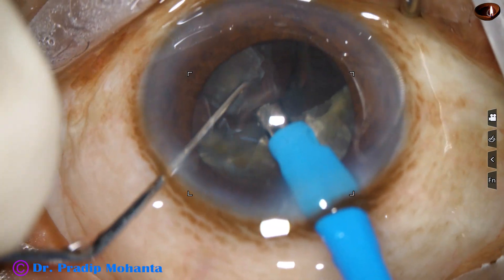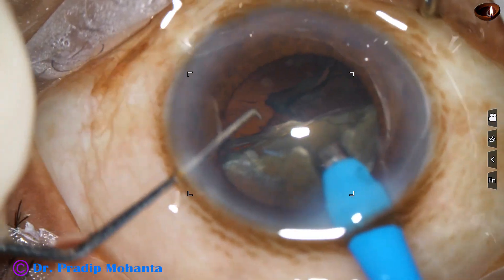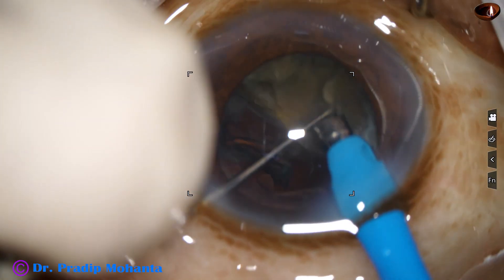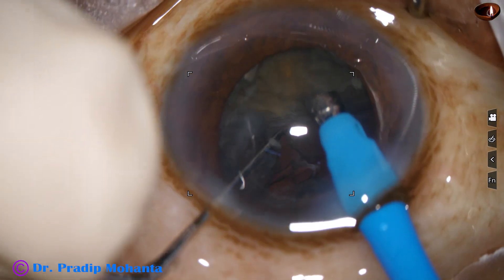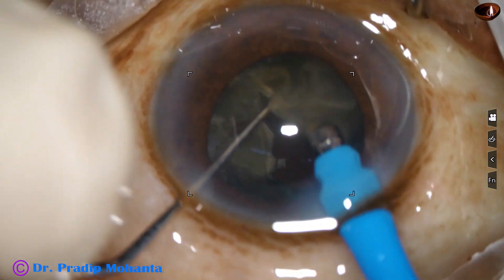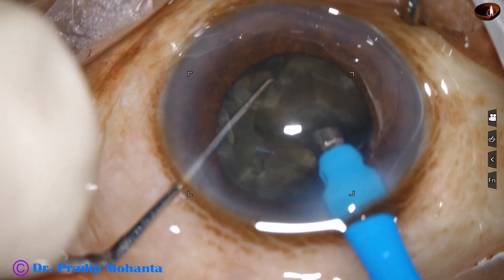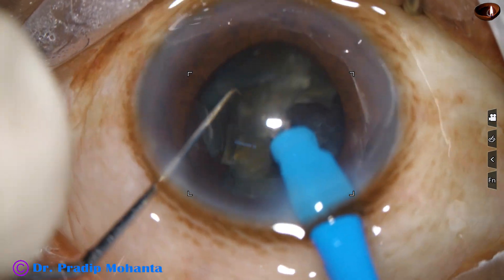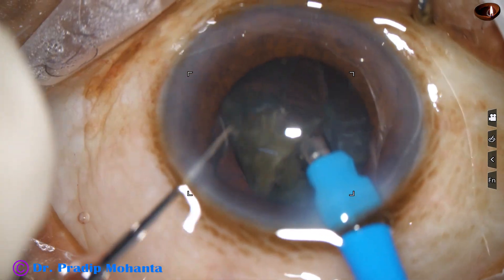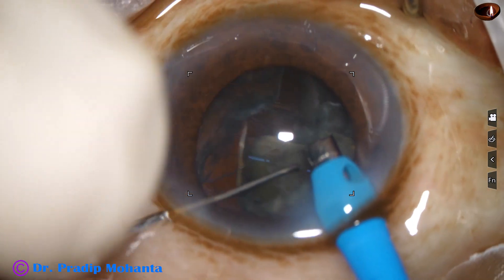Each nuclear piece is tilted and emulsification is started from the apex. The other hemi-nucleus has been chopped. Ultrasonic energy is high, but it is kept far away from the corneal endothelium. Most of the time the phaco needle is at the central part.